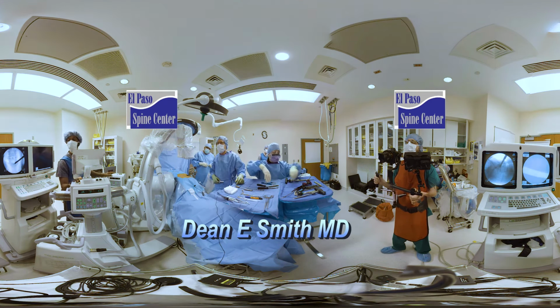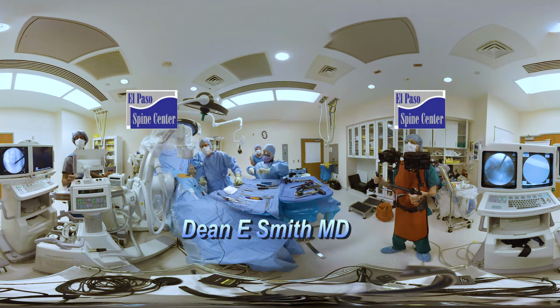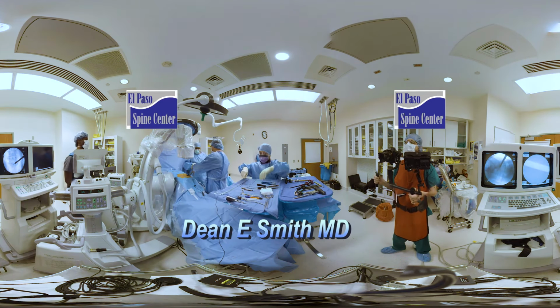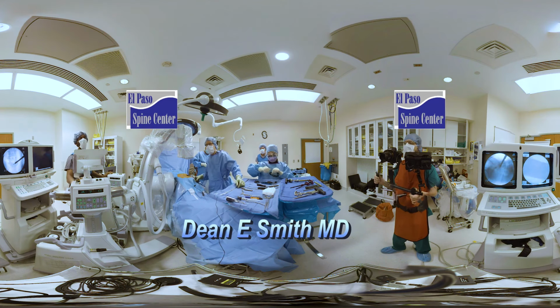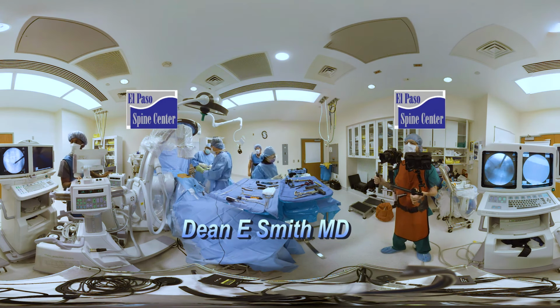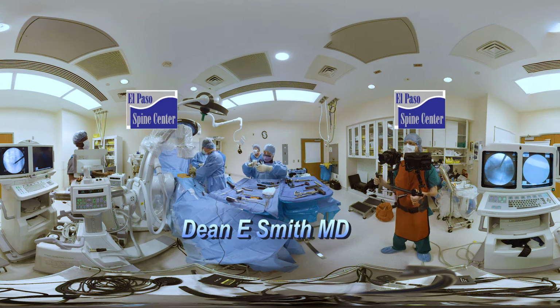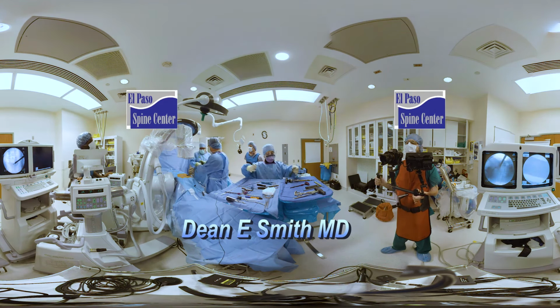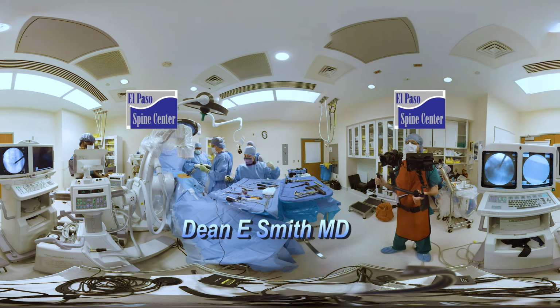AP, lateral. Actually, I think it looks pretty good. AP, lateral. Yeah, that actually opened it up really nice. I think that's probably good on that. That's already bouncing back. So we're gonna do this.